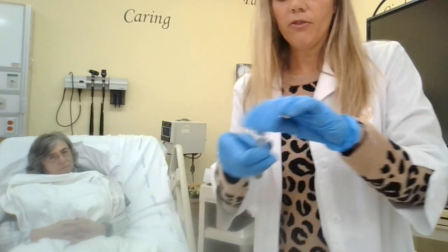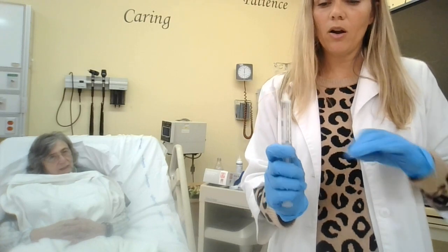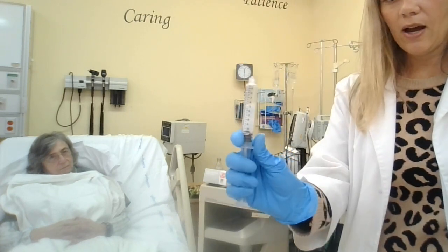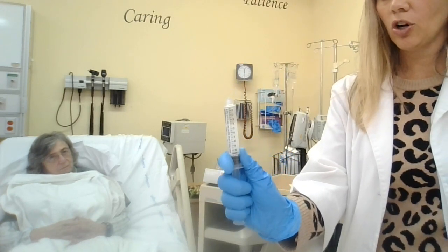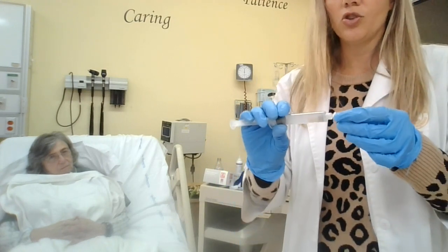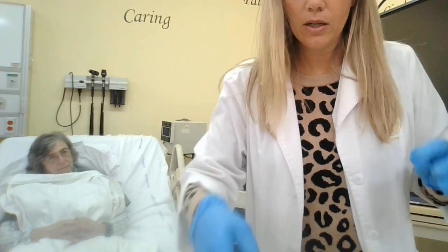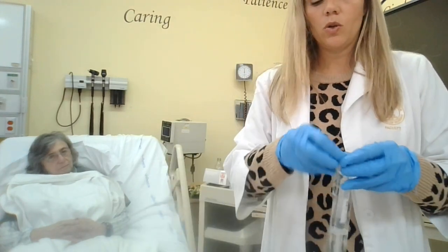Now, saline flushes are pressurized. So if I just push up to get rid of the air, it's going to spray out. So a way to avoid that is pull back gently on the plunger and then push up so that you can see the fluid at the end there. And then you know there's no air. We're going to do that on both, so it'll be easier for us when we're ready to give it before and after. So I'll do the same thing.